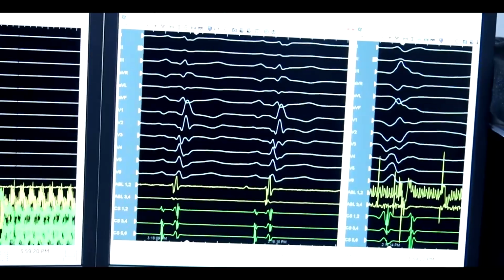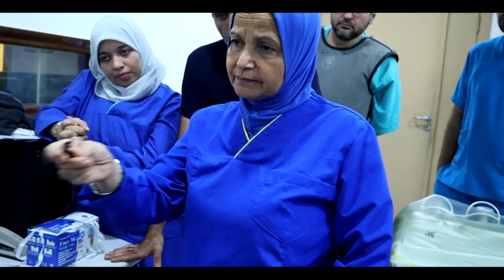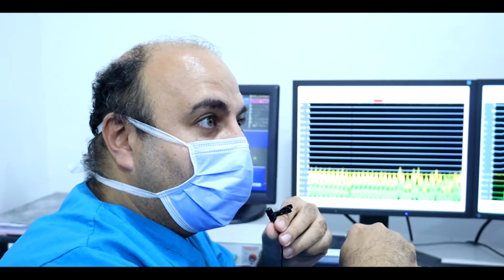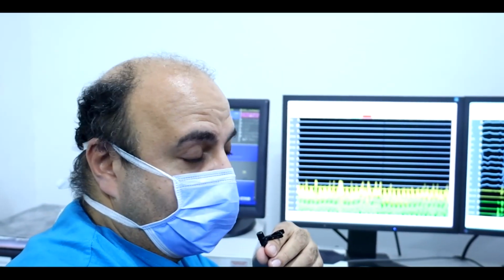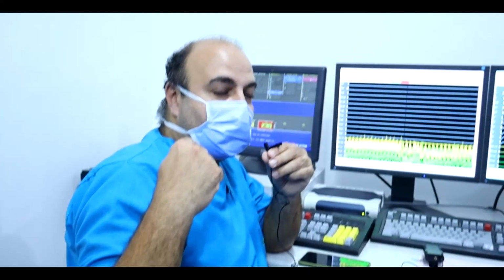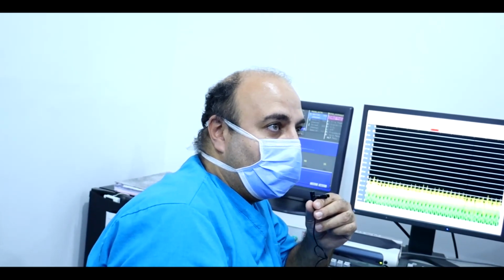This is non-clinical. So that was a nice case of non-sustained automatic VT coming from a scar in the anterior wall of the left ventricle? Or scar related? It is not automatic. It's actually the impulse, which is good. When it travels to the left bundle, it depolarizes the ventricle, but at the same time it travels down an isthmus, slowly conducting, so coming to give PVCs immediately after the sinus rhythm, and this isthmus can continue a loop to give non-sustained VT and may stop, and then another sinus beat makes a right bundle sinus rhythm, and after it goes to the PVCs.